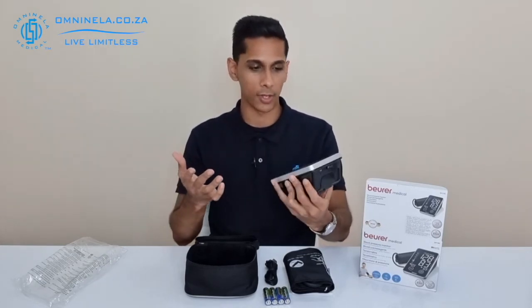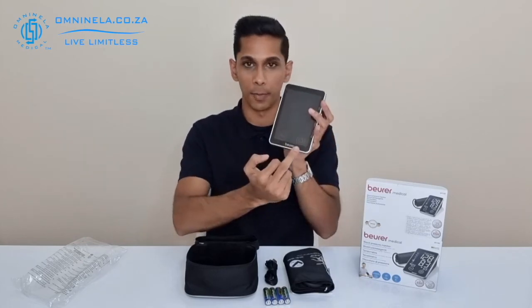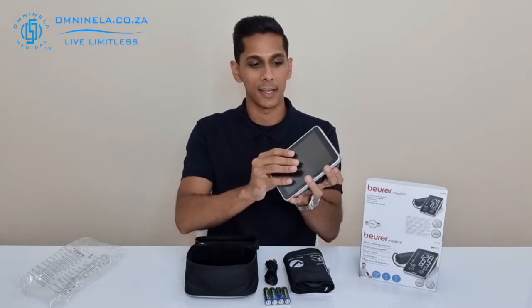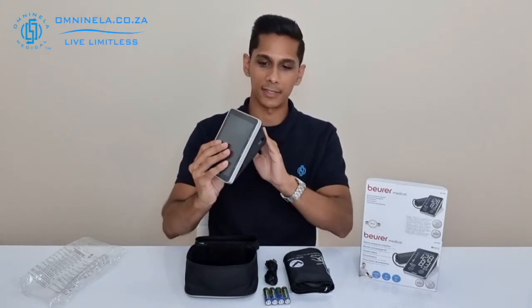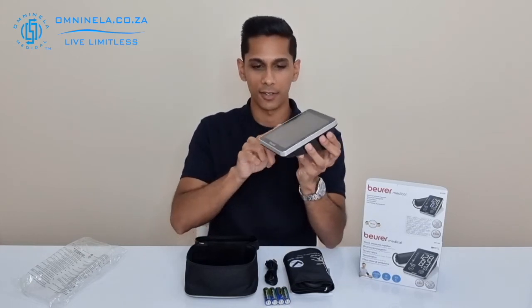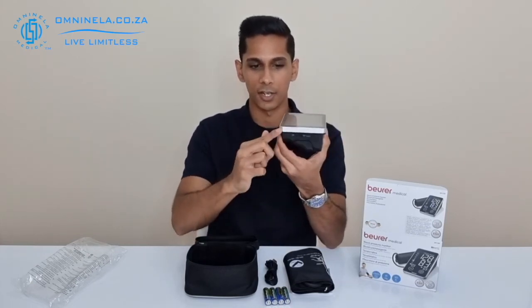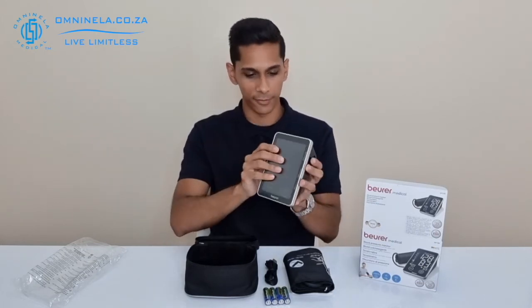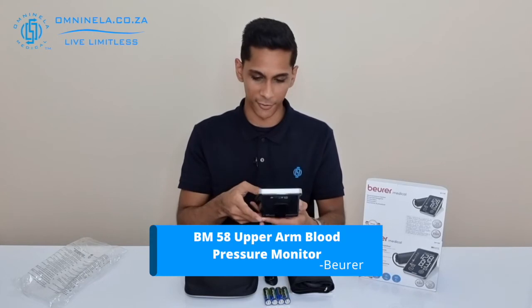Looking at the overall item, you have your power button and your memory button that you will use to control the device. It features a slick gloss black on the sides and the bottom, surrounded by a matte finish on the sides. That covers the general overview of the BM 58.